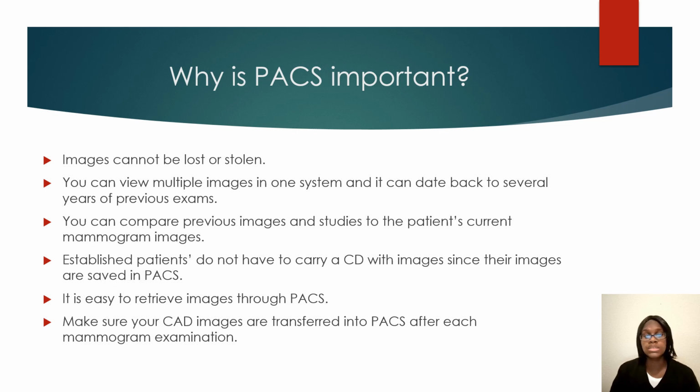So it's very important to get in the habit of knowing how to work your PACS, because this is very helpful if you need to remove an image or if you need to verify or view an image for the radiologist or for yourself. And another tip is, whenever you send your images to PACS, make sure all of it has been sent before you verify it, because when you verify those images, you're putting it on the radiologist's workstation saying, hey, it's ready.